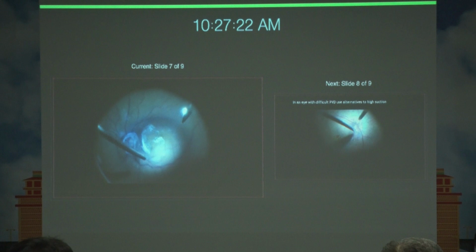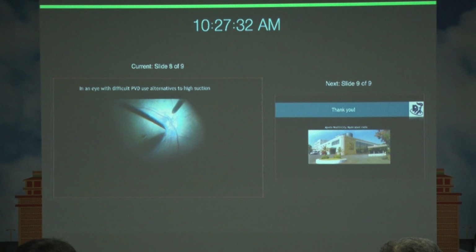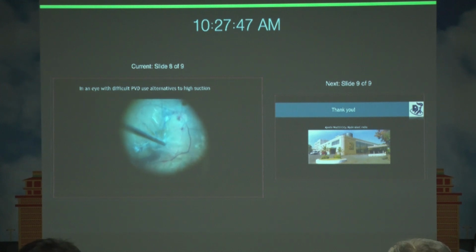So similarly, another patient where we are using cutting over the macula, because this is again a patient with impending macular hole, so risk of deroofing. Just cutting over the posterior vitreous, not aspirating. And then, as the previous talk, sometimes whatever suction you apply, you cannot lift up the vitreous, then just use a pick and a forceps to induce PVD. This is vitreous actually, this is not a membrane.